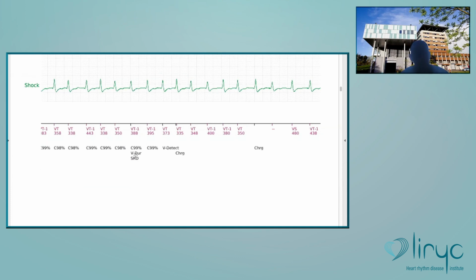SRD means that you have programmed a sustained rate duration. And so at the end of the duration, we'll start a clock saying that if, for example, after 1 minute, you still consider it's SVT, whatever, I will treat it as a VT. Okay, I will stop analyzing the morphology of the signal, and then I will consider systematically that it is a VT. So for prolonged SVT, this is what will happen. The patient will receive inappropriate therapies.